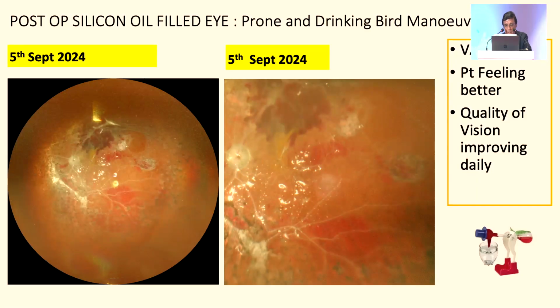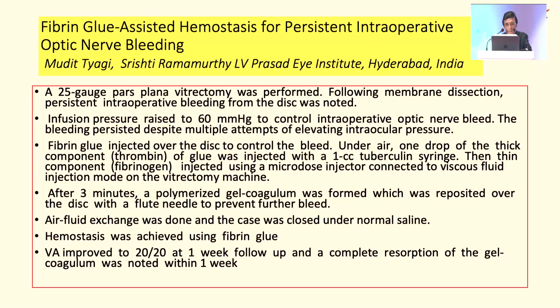The retina is quite ischemic in the macular area. All the membranes have been cleared from the disc. The heme has moved from the macula subretinally. So that is a way we can do these cases.